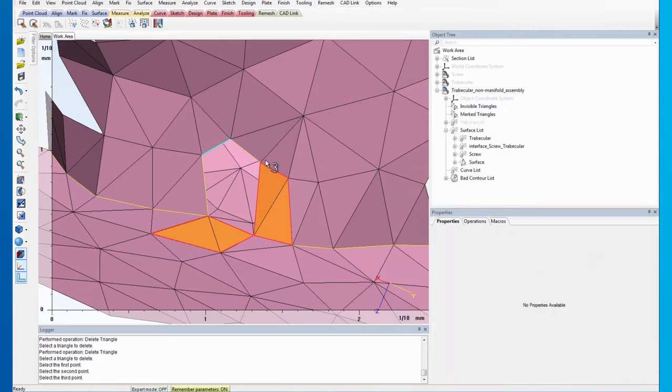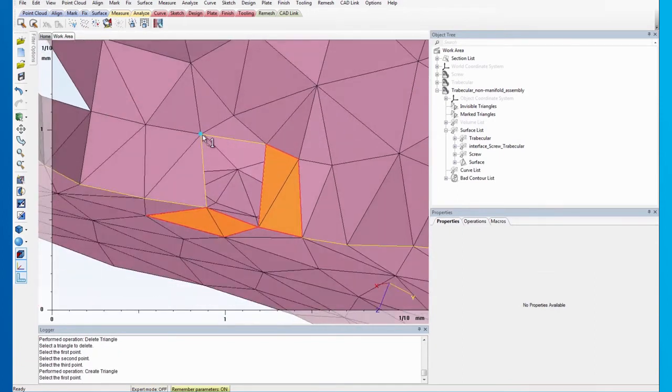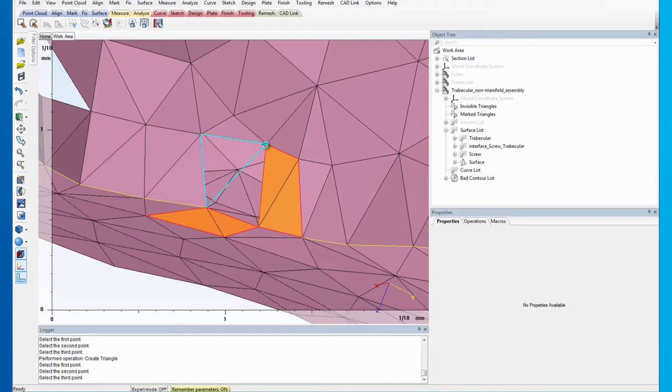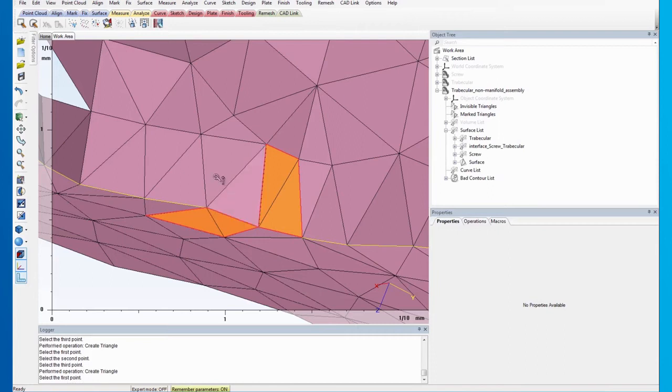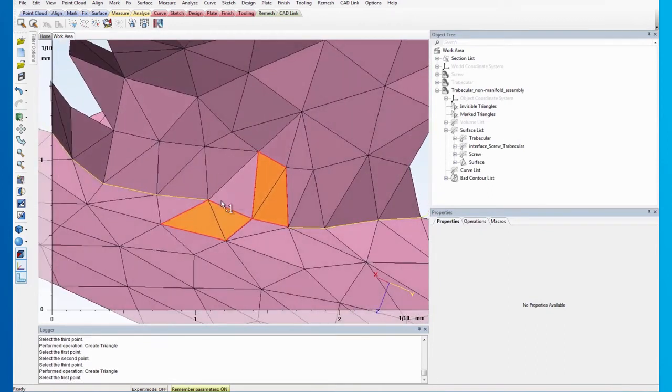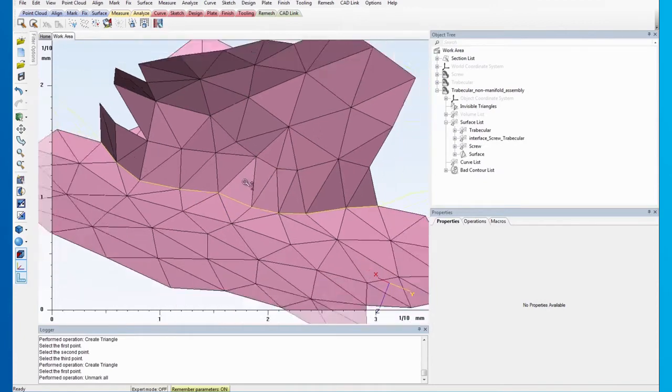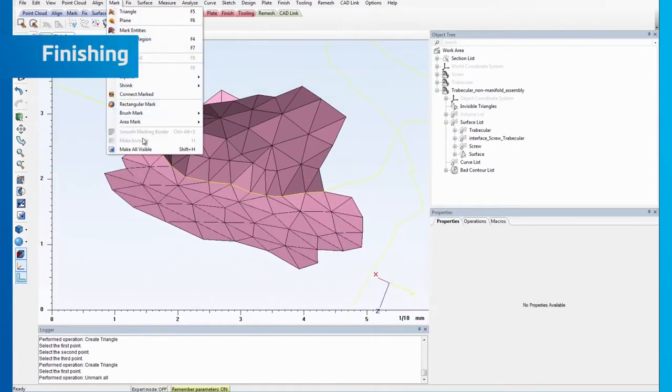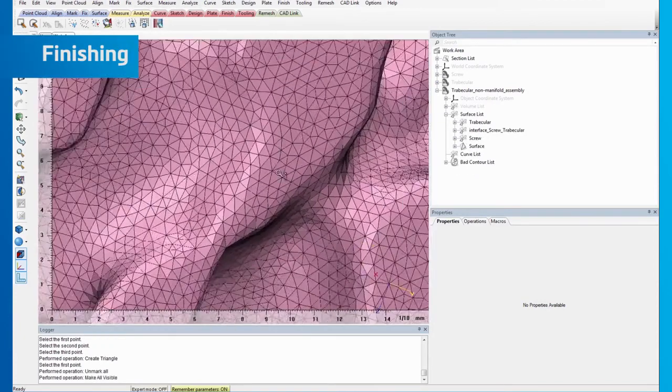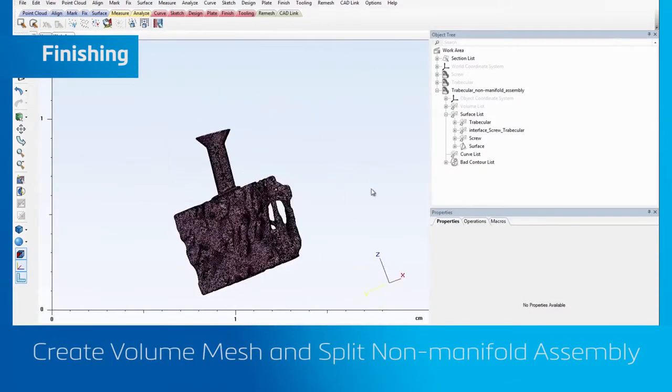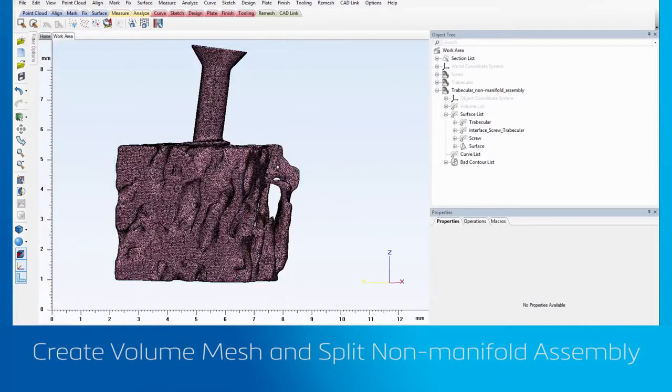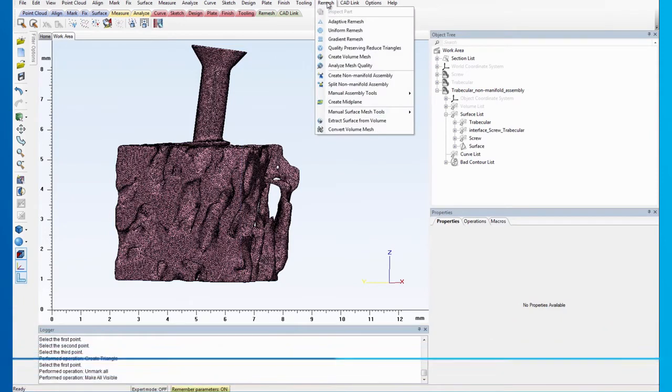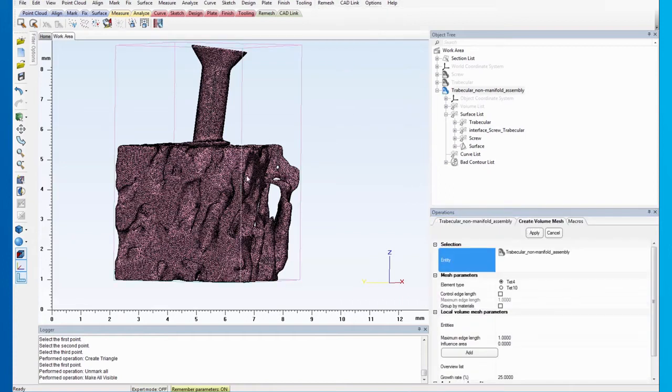After deleting the triangles, we can proceed with patching the hole. After that has been done, we can make the assembly visible again and recreate the volume mesh. Select the same parameters and after applying the steps, you will see the bad volume element has been eliminated.